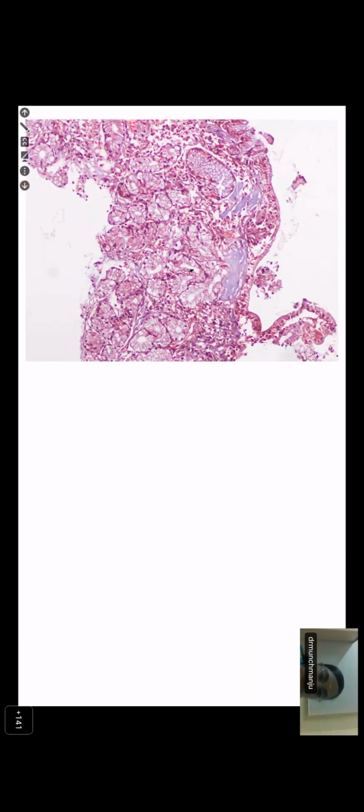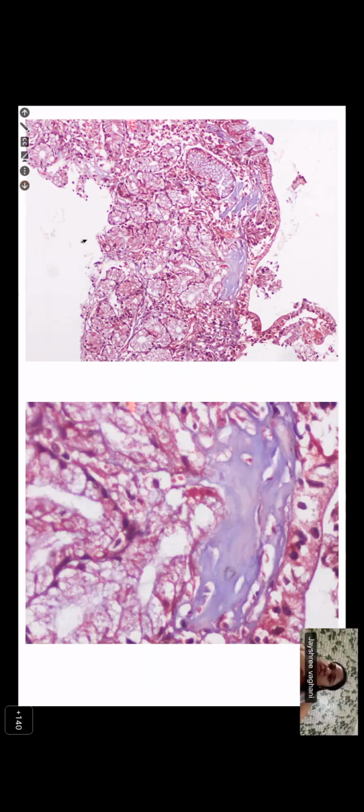So this is a trichrome stain. Okay, what does it show? Blue color, ma'am. Collagen. What does that suggest? There's a subepithelial collagen deposition. Okay, and what do you think? How much? Okay, we'll go to the next slide.